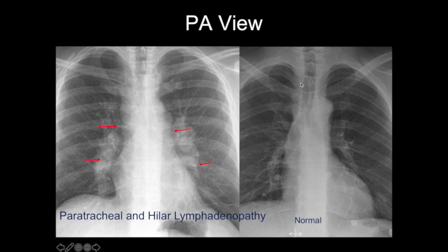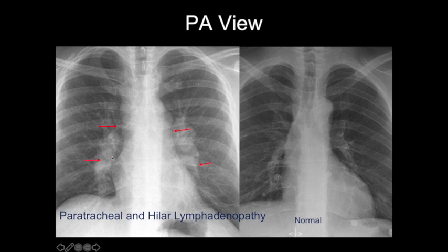Our paratracheal regions — the right paratracheal stripe should be thin, but it's very thick here. There's a lobulated contour to both sides of the mediastinum, which is not normal. Look at normal hila: sometimes the vessels can look more prominent and that's okay, but they're still very linear and vessel-like. These are clearly very lobulated and rounded — these are abnormal hila.